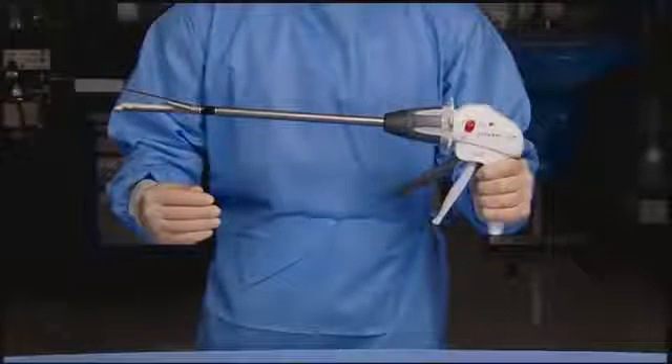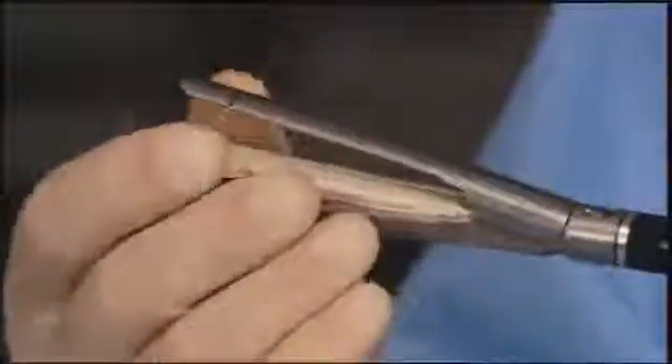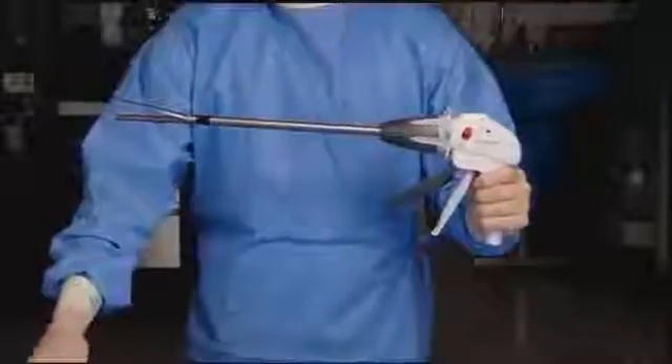Prior to reloading, ensure the instrument is in the open position. Push upward toward the anvil to unsnap the reload from the cartridge jaw. Discard the used reload. Prior to reloading the instrument, rinse the anvil and cartridge jaw in sterile solution.